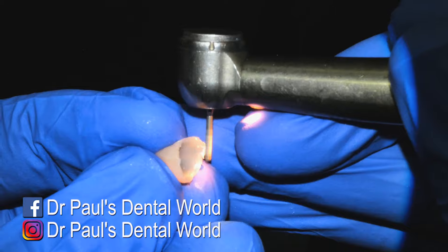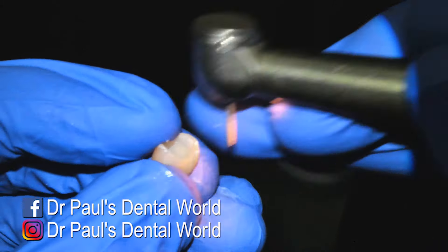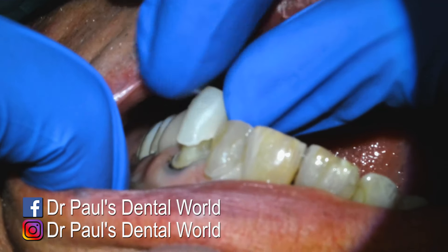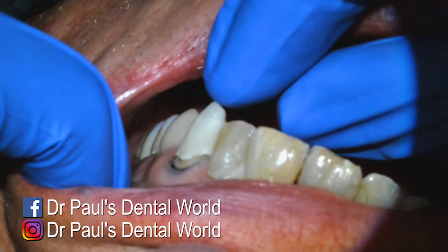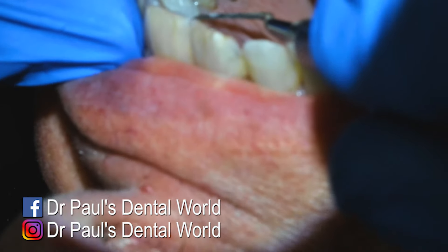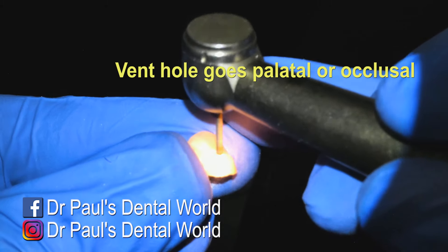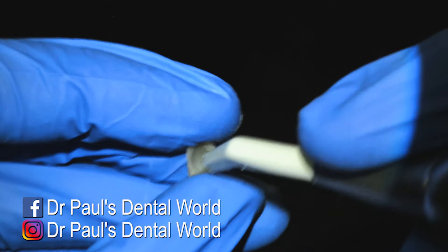The better that you can get this fitting and the smoother it is, the more comfortable it will be for the patient, the less chance of any gaps, the healthier the gum is going to be — it's just better all around. And then we try that in and I'm really, really happy with how this fits. And then I'll use my flat plastic on one of the sides to get that out. And then I'm going to put my vent hole — that goes through on the palatal. If it's a posterior tooth, you're going to do it on the occlusal.